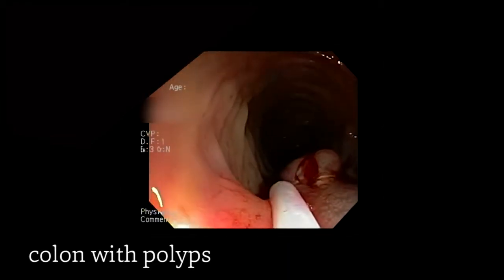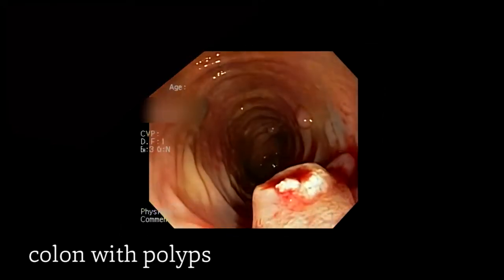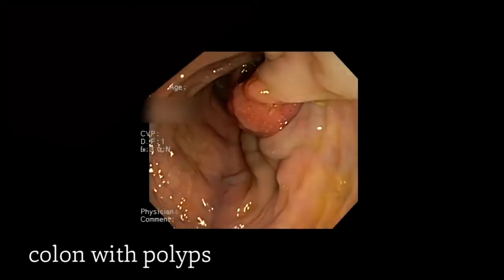This polyp was too large to be suctioned into the suction portion of the device, so we actually had to remove the entire polyp from the colon by suctioning it into the device and then removing the colonoscope.